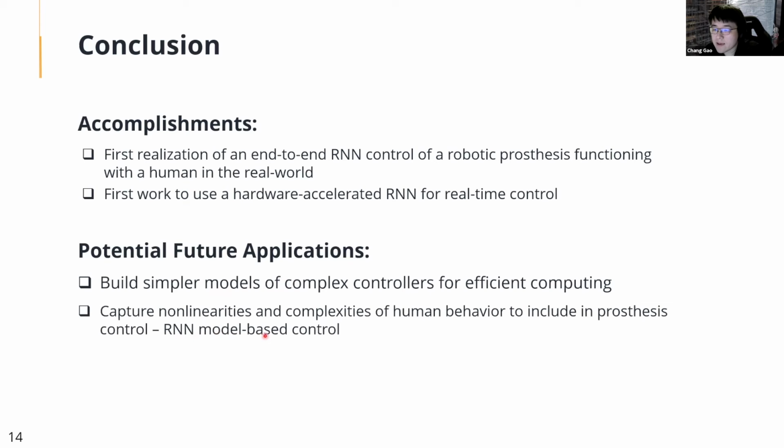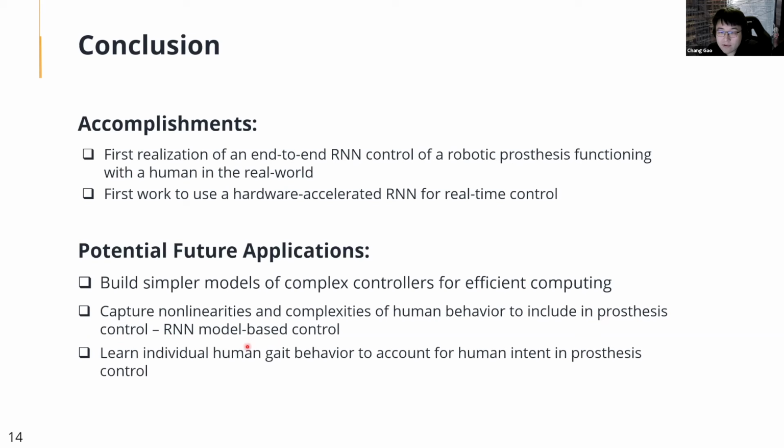Secondly, we want to capture non-linearities and complexities of human behavior to include in prosthesis control, like RNN model-based control. And finally, I want to learn individual human gait behavior to account for human intent in prosthesis control.